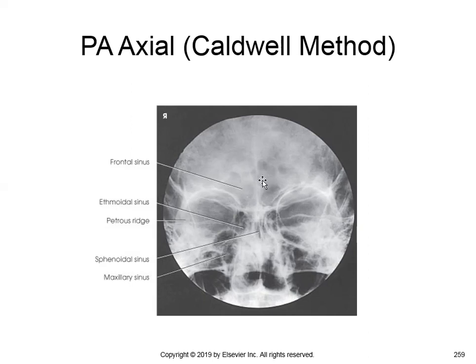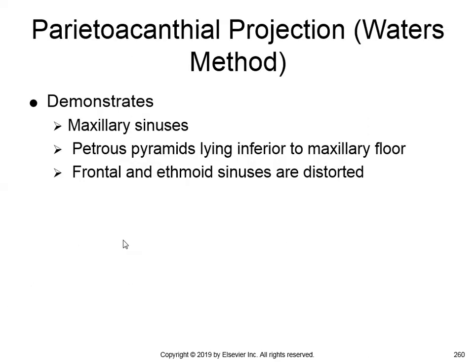But what we're looking for really is the frontal sinus, which is what we're seeing here. Frontal sinuses are really pretty thin, but they should stand out a little bit better than what we're seeing here. This patient appears to have something going on inside that frontal sinus. I don't know if they've got a headache or a sinus infection, if they presented with a headache or what exactly.